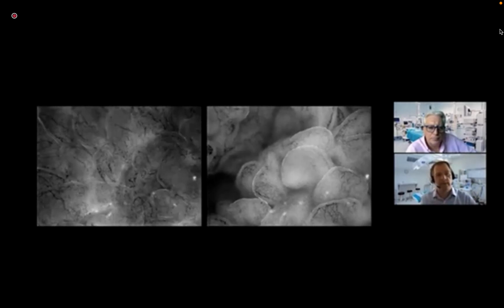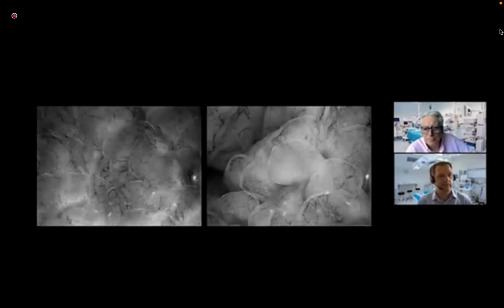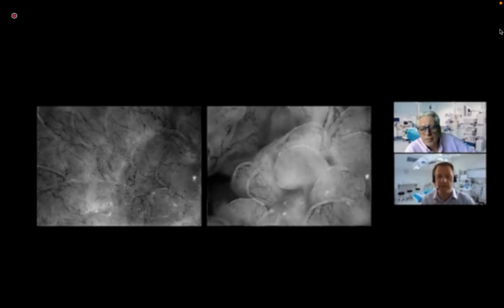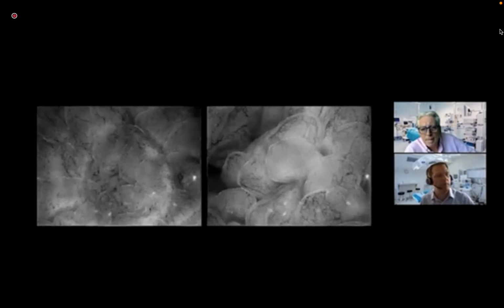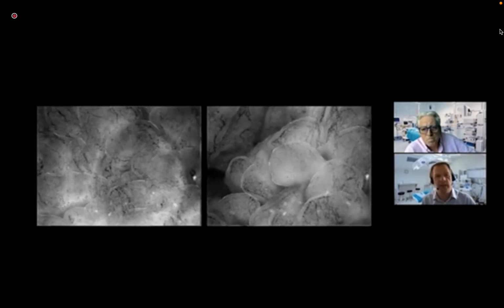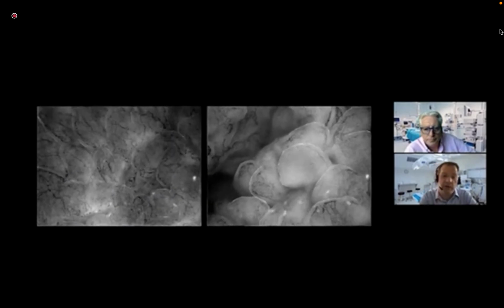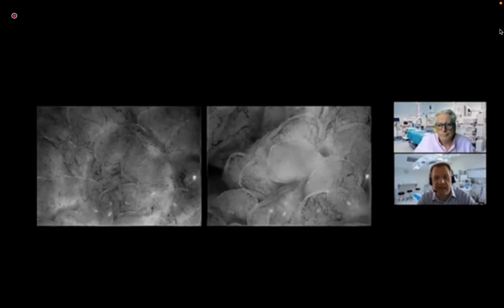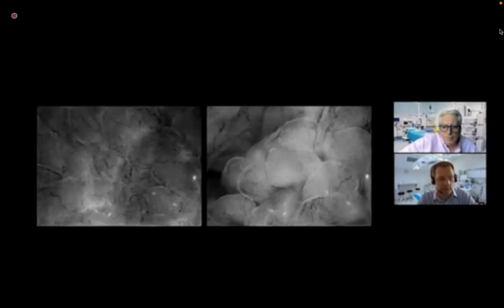Very much so. Beautiful pictures there. Left-hand side as we look at it healthy. Yep, and the right-hand side, I mean, we've got straight away quite a blanched villus in the centre there with not much flow. And we've got a change in the way the blood is flowing. In our baseline picture, that flow was constant and non-pulsatile. And now what we're seeing is intermittent pulsatile flow in those villi, and that is abnormal.